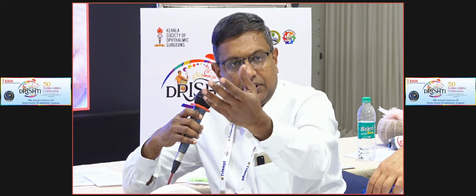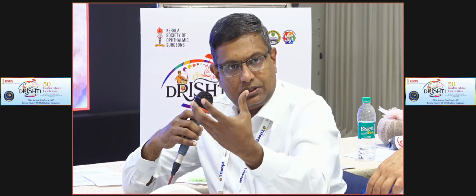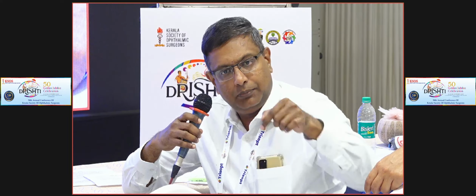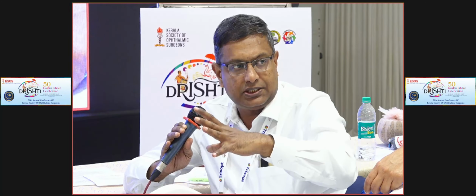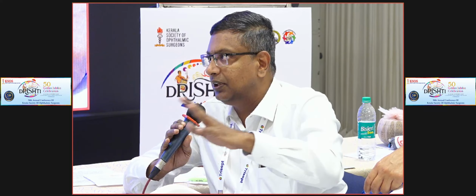In a normal situation with intact zonules, there is no problem. The tear will go up to the zonule. But here there is no zonule. Plus, the rest of the capsule is stretched because of the CTR. So, it comes as a small V, becomes a larger V, then goes posterior, and then finally, like opening a curtain, the whole thing opens out. So, you have to pull out the bag, you have to pull out the CTR, and it is like snatching defeat from the jaws of victory, because you are at the point of placing the lens, completing everything, and then everything is lost at that stage.